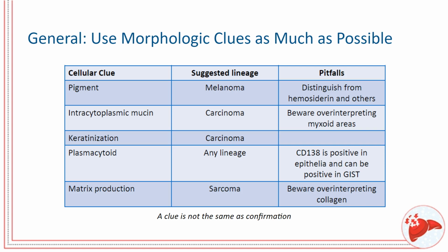And I think an important clue to at least have some clear guidelines in your mind about are the plasmacytoid neoplastic cells. These actually occur in a range of tumor types across lines of differentiation. So you can see plasmacytoid cells in hematolymphoid malignancies. Malignant melanoma can appear plasmacytoid. I've seen this with GIST. Of course, carcinomas can do it.